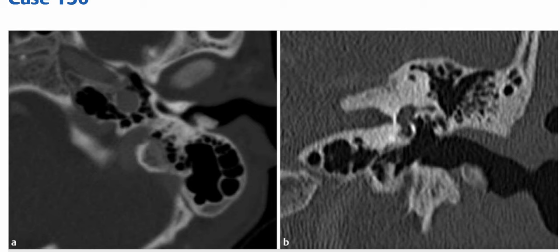These are images of a 14-year-old boy with abnormality on physical examination. On the axial CT scan, there is focal calcification and narrowing of the left external auditory canal. On the coronal reformatted CT image of the left temporal bone, there is calcification at the junction of the cartilaginous and bony external auditory canal. Pedunculated morphology was seen on sequential images. Considering this key finding of circumscribed external auditory canal calcification or ossification, the diagnosis is external auditory canal osteoma.